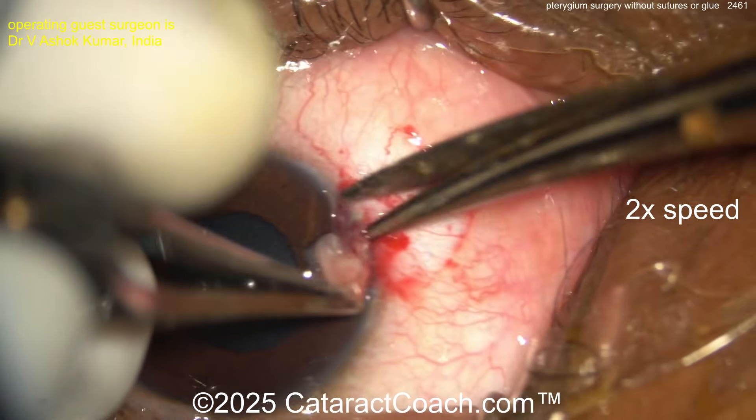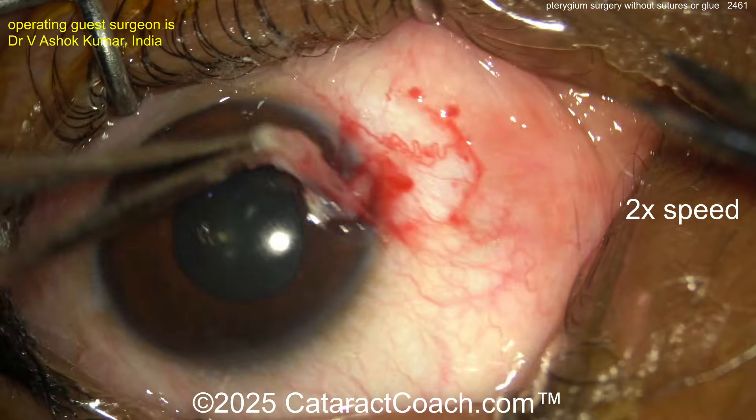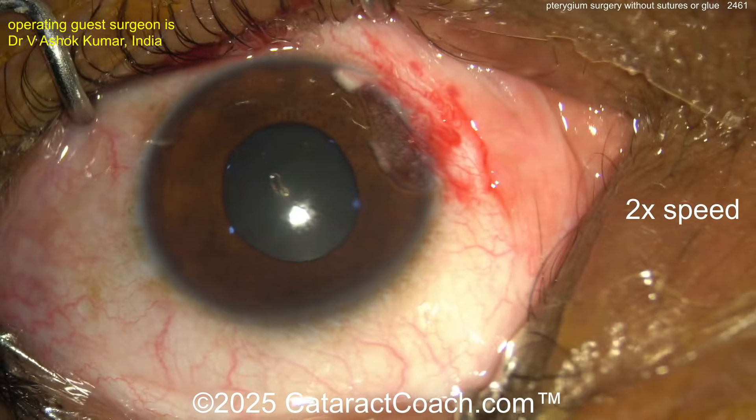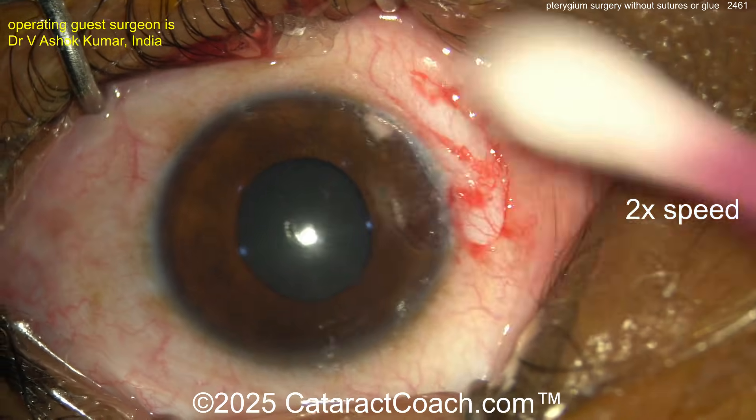Remember, this is just the tip of the iceberg — you probably want to do a bigger dissection to get the root of the pterygium too. You can actually peel it off the cornea — there you go, nicely done. The pterygium is gone, at least the tip — the part that was on the cornea.